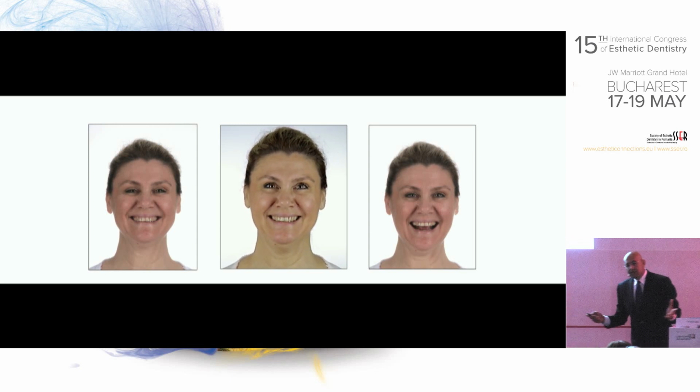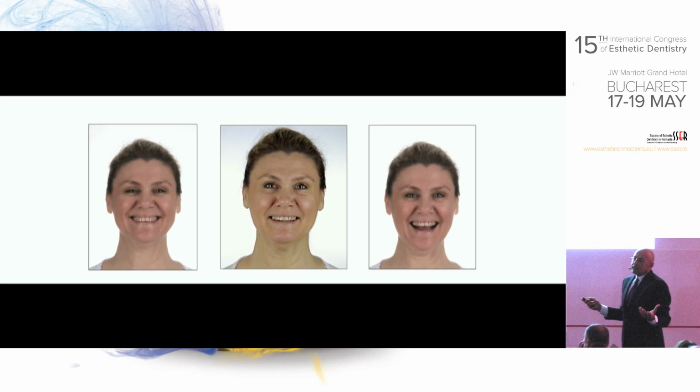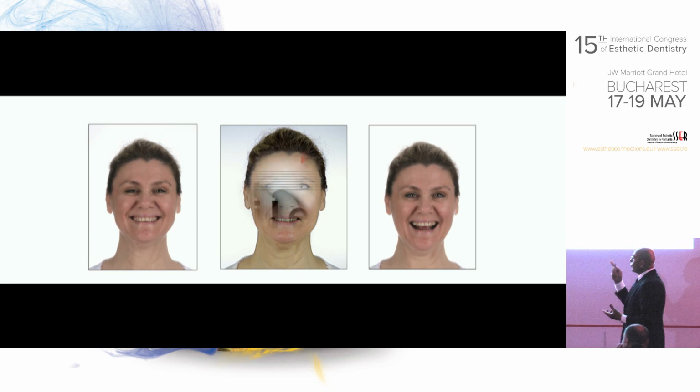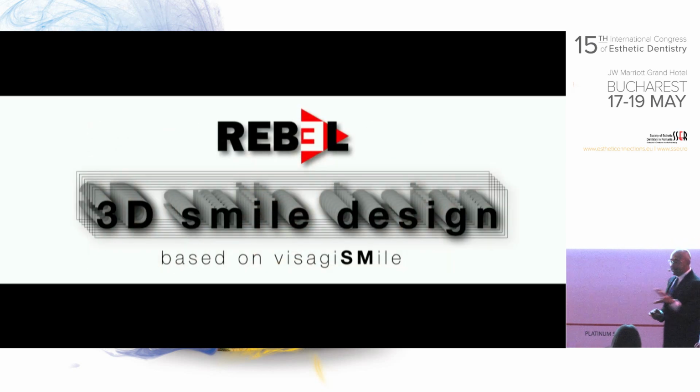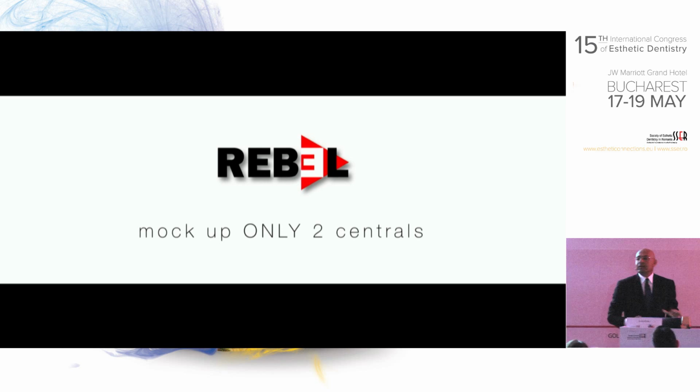Okay, let's say I'm lazy. Let's say I cannot do the best mock-up. So with the Rebel, which is based on the same concept of Visage Smile, the only thing we have to do now is to mock up only the two centrals. Tell you the truth, one is enough.